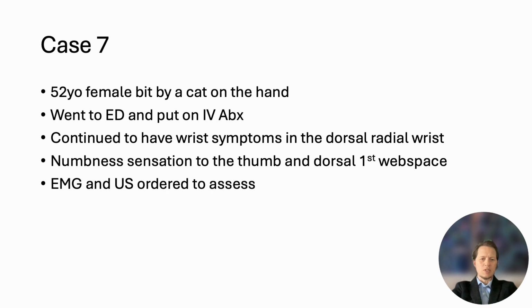So, of course, someone said, okay, let's order an EMG, but also an ultrasound. We'll talk about that as well. So we veered a little bit from our typical format where we present the nerve conduction stuff first and then build the differential. This had just a very interesting history that we started with in terms of the cat bite.